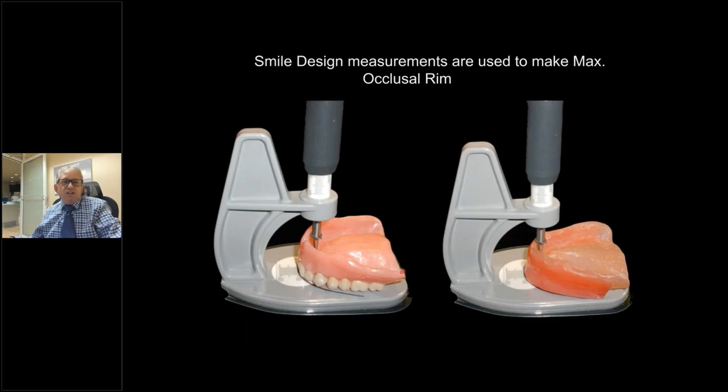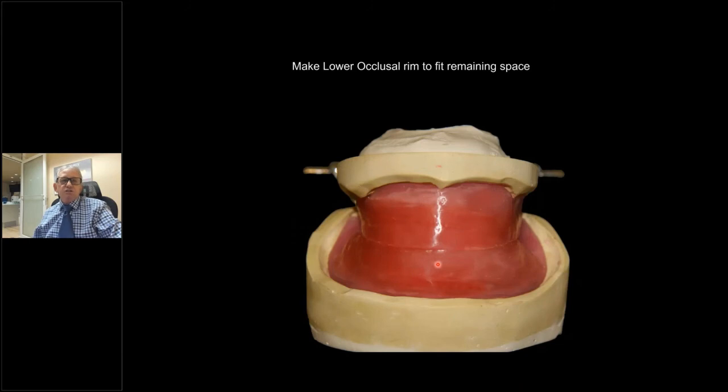So we turned around and used the denture gauge and the papillometer. We took this measurement here, and we got an incisal length, and we also got a labial position. Kelley Dental Lab made your occlusal rim to match that exactly. And they made your occlusal rims for you.